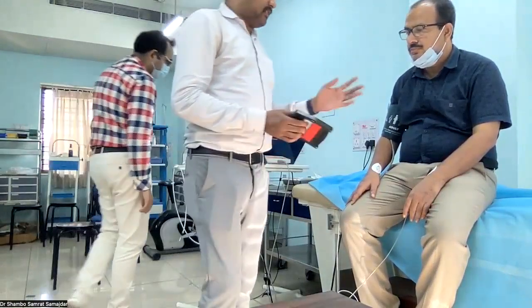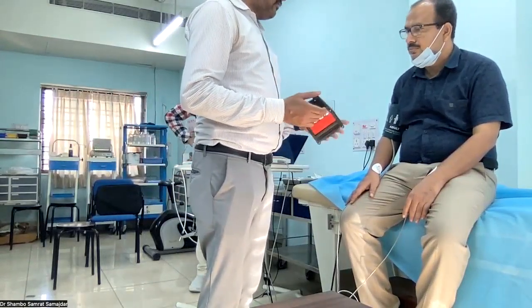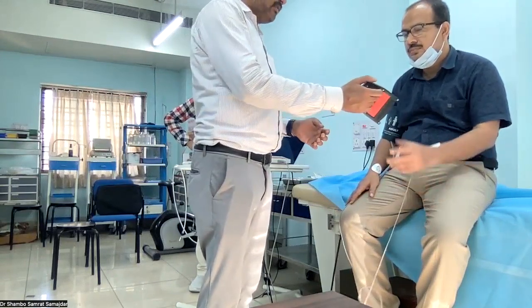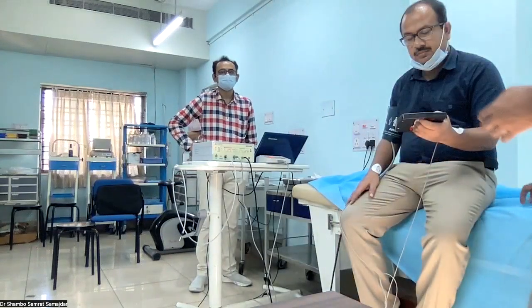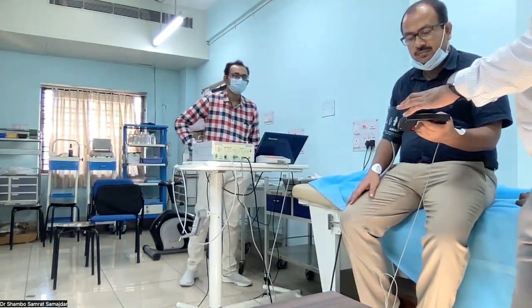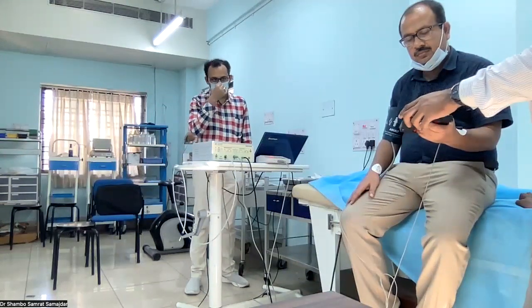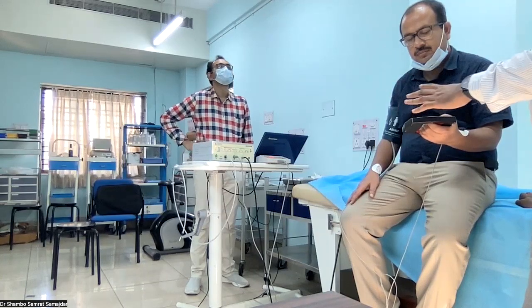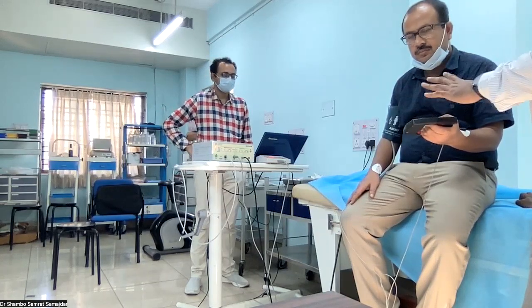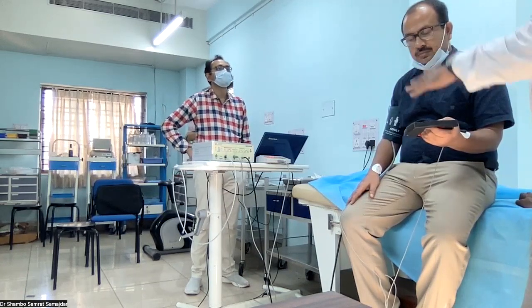You have to ask the patient to hold it with his non-dominant hand. So I think you are right-handed, so you'll be holding this with your left hand. And we will ask the patient to hold this as tightly as possible. After that, we will record the BP. Before starting the hand grip test, we record the normal blood pressure while the patient is in sitting position. Then after pressing the bar, we will record the BP once again.